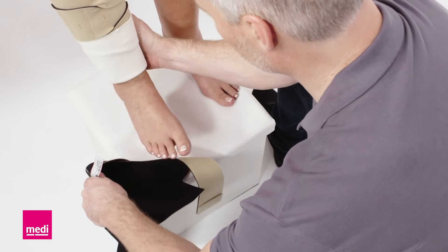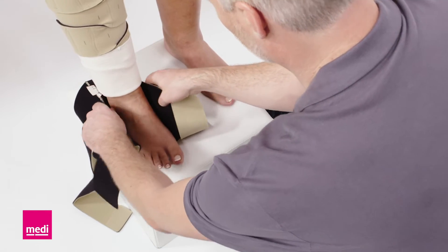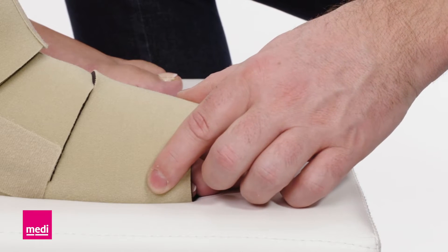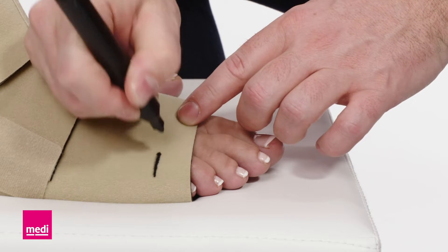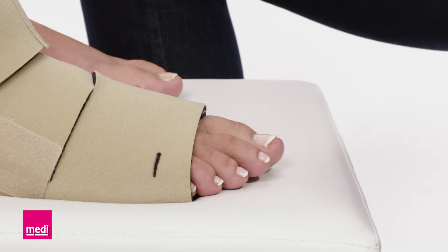The heel should rest firmly in the heel opening. The front edge of the garment should align with the base of the toes. If necessary, you can shorten the foot length. Mark the point where you want to shorten later and draw a straight line. Cut off any excess material along this line.